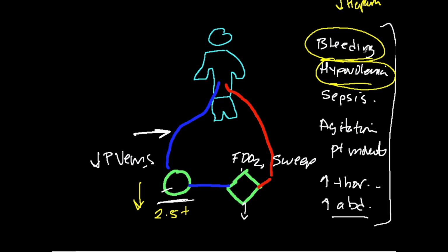But there can be some other things too, such as catheter position, that require some ultrasound and radiographic studies as well. And so if you're not really sure what's going on, you have to cast a very wide net and make sure nothing big and bad is out there burning you.